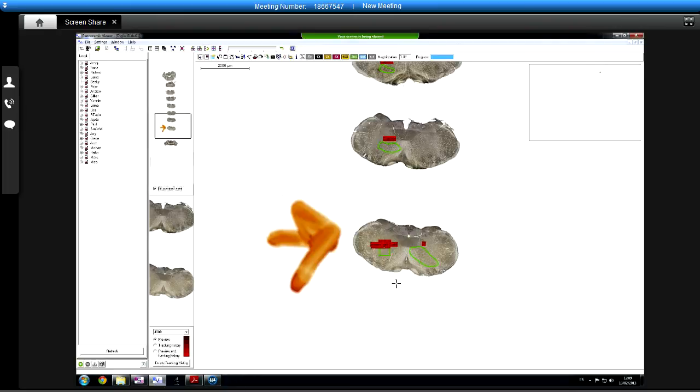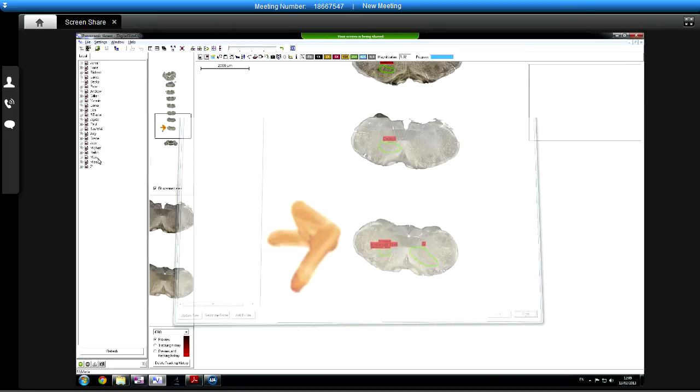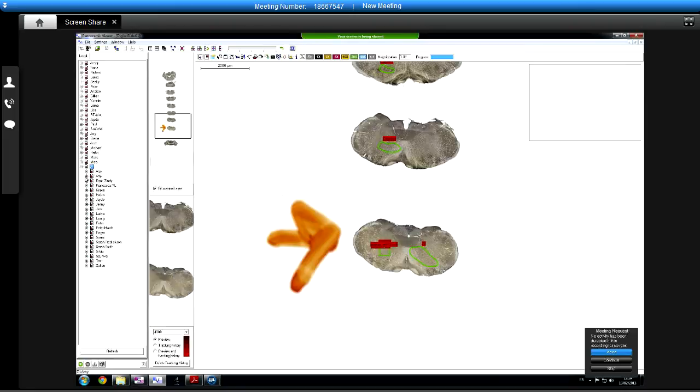So yours is. Are these pointing at a local drive or the network? They're all local ones. Okay. There's no network. Okay, so I'll just temporarily put that in. So what I can do, you select the slide here, so that's the one we're working on at the moment. Hit the plus sign. Let's just pretend that that was one of your slides as well. It will make complete rubbish. So we add them into the list there.